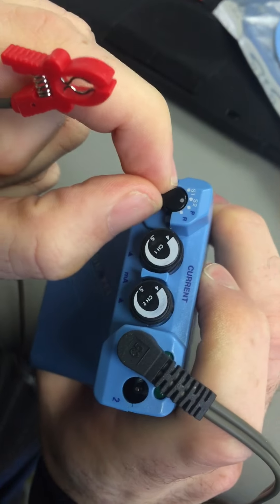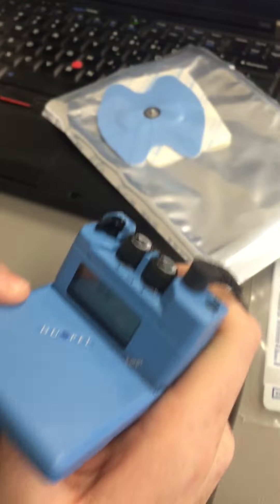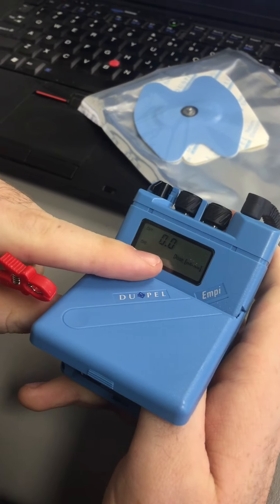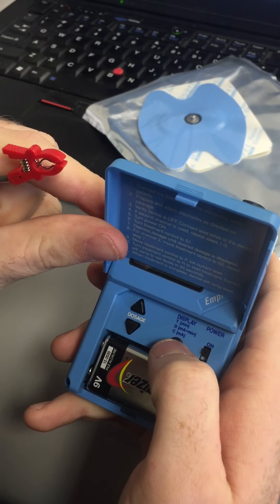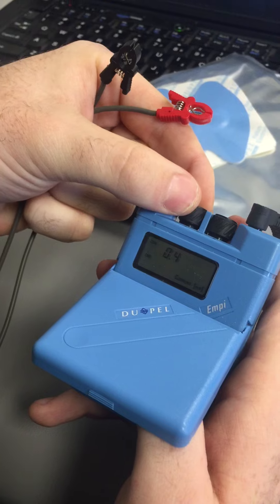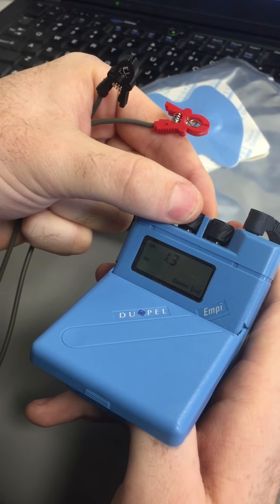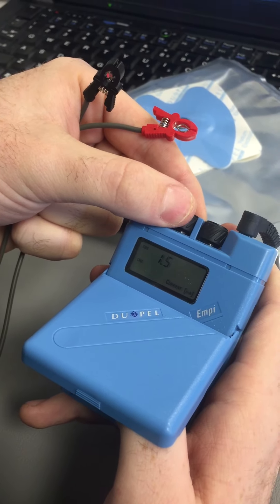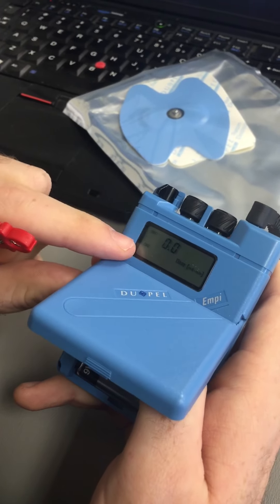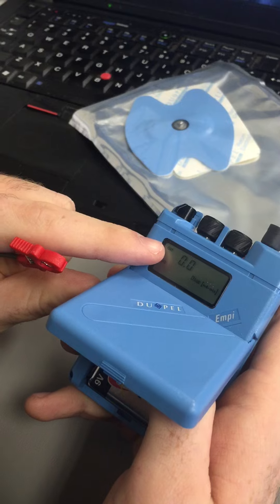We go right to P — we don't need that other channel, so we skip S2. Here we adjust the current using this black button, go down to current, and use the knob to set it. We're going to start her at about 1.5 mA — that's a safe current magnitude to start with. That's going to automatically change the treatment time, and the dose is zero because it hasn't started yet; it will count up.